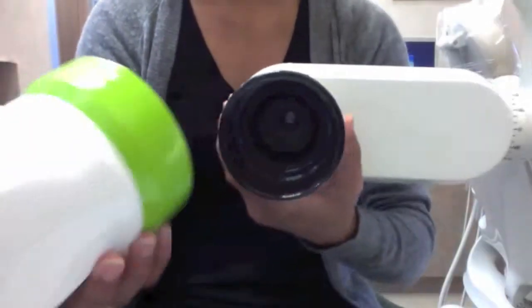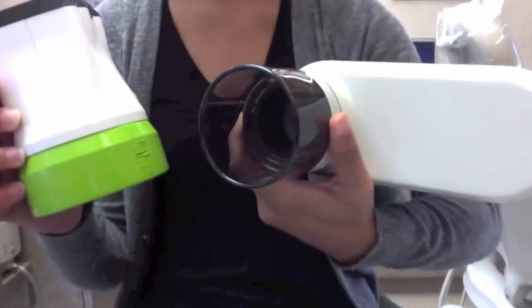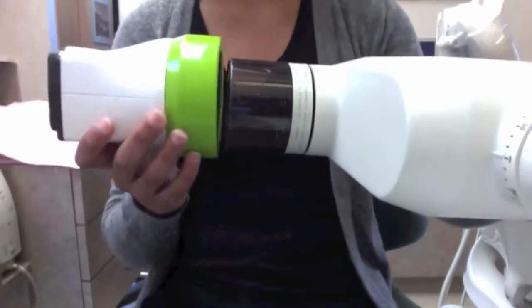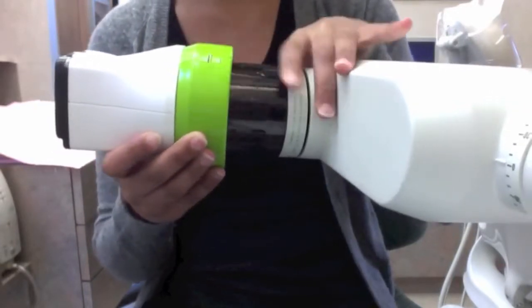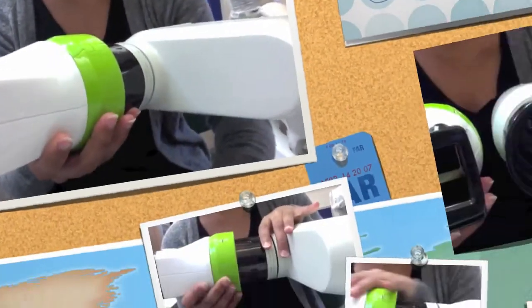So this particular collimator is different than the one that we have in Gleason, because the one in Gleason gets fitted into the round PID, as opposed to this one. This actually goes over and fits over the round PID, and it kind of lengthens the entire collimator.